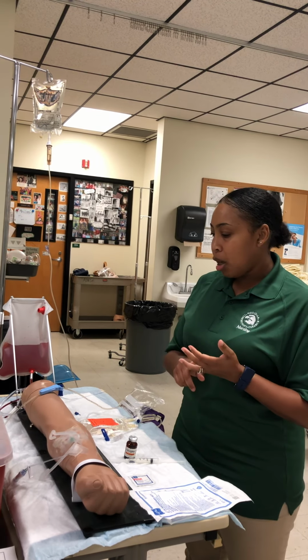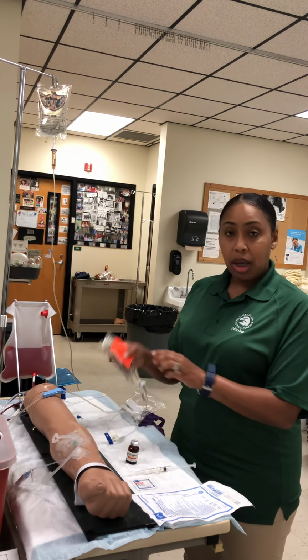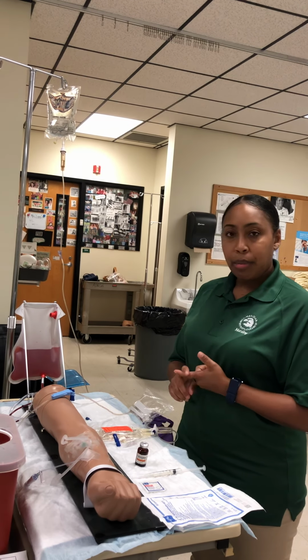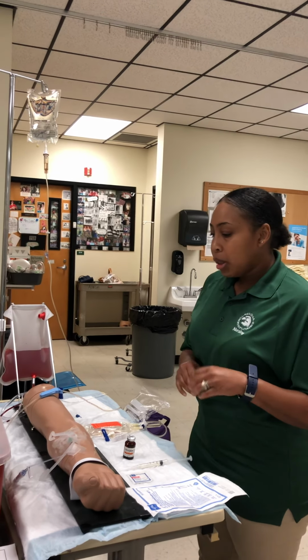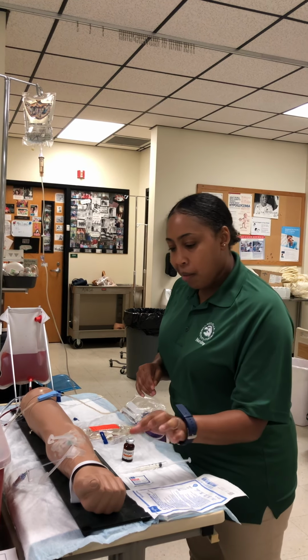Hi, my name is Nurse Dawes, and I'm here today to administer some Lasix IV Push and gentamicin. Could you verify your identity for me by telling me your name and date of birth? Okay, great, Mr. White. Do you have any allergies? Okay. I'm gonna check your armband just to verify your identity.